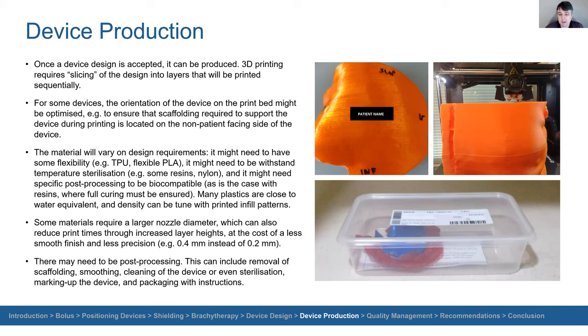And as mentioned, there needs to be some post-processing, which will probably mean removal of scaffolding, maybe some smoothing of the device, cleaning of it, potentially sterilization, packaging and marking up for placement on the patient.